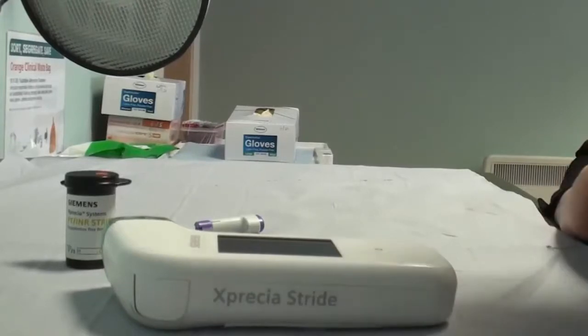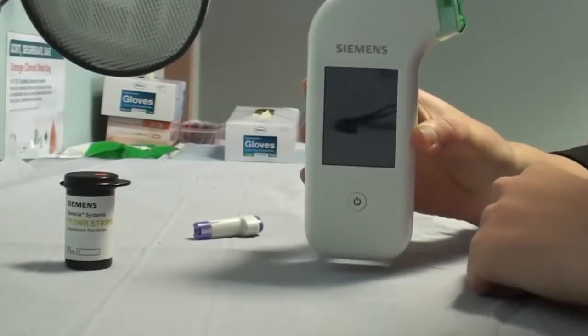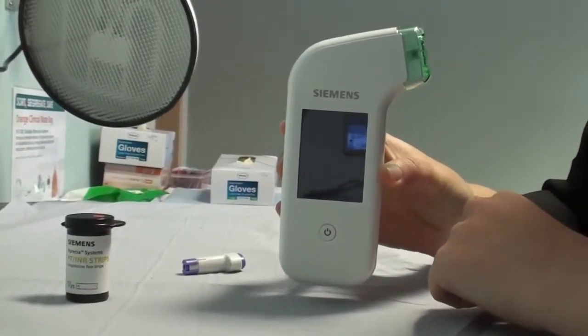Hello, I'm going to talk you through how to use the Siemens machine in order to obtain an INR result via finger prick test.